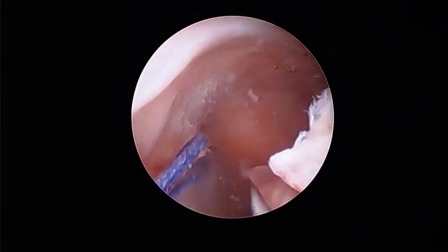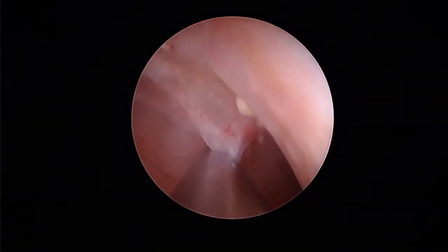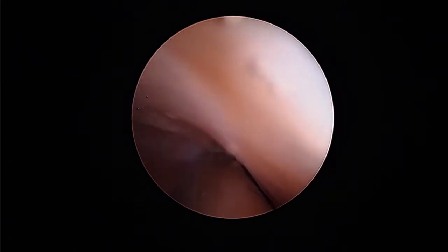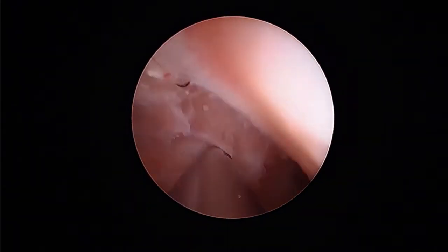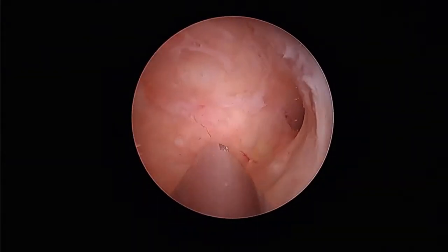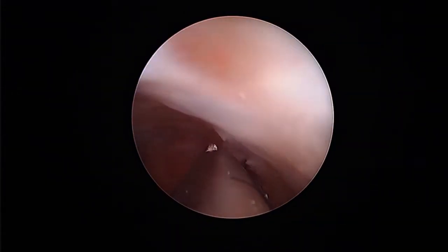Here the morcellator is reducing polyp size and tissue load. We can see the tubal ostea to the right of the morcellator. The morcellator is shaving the endometrial lining.